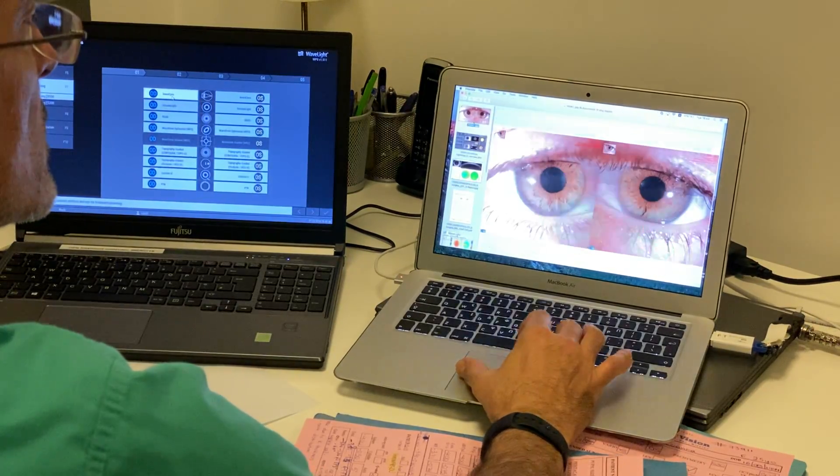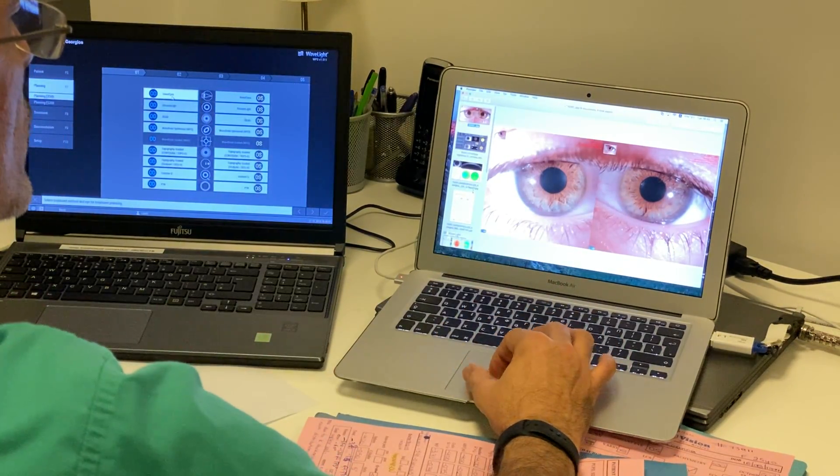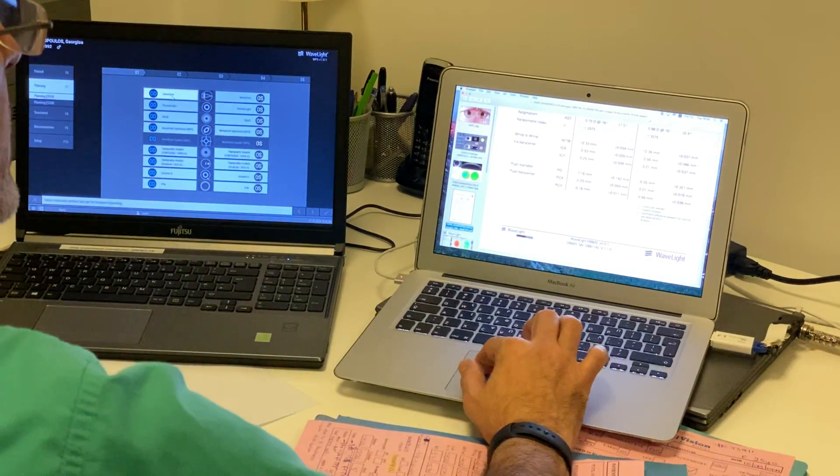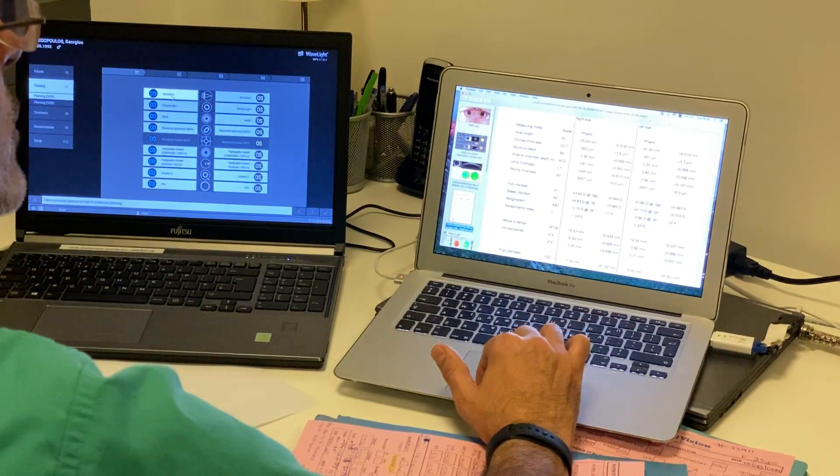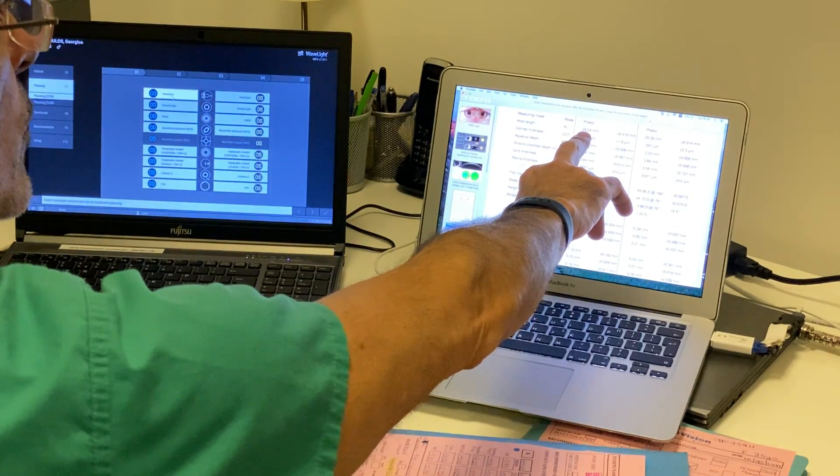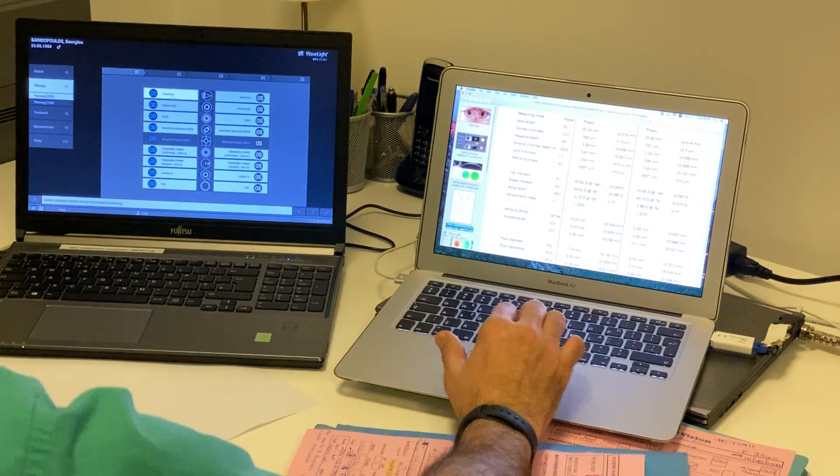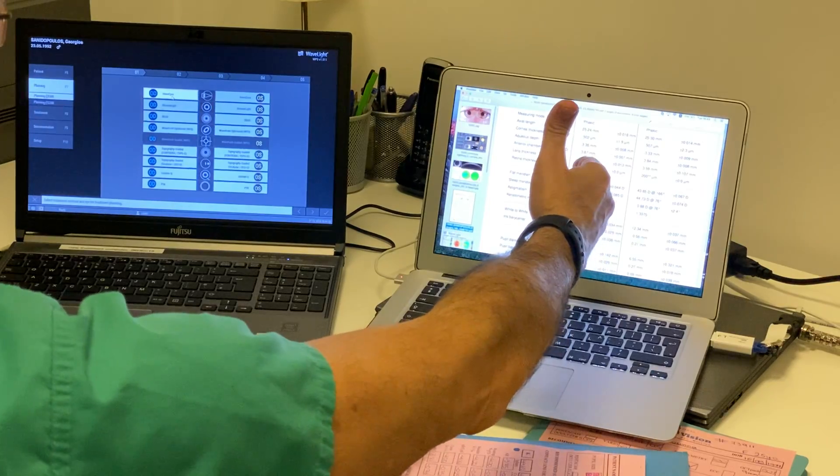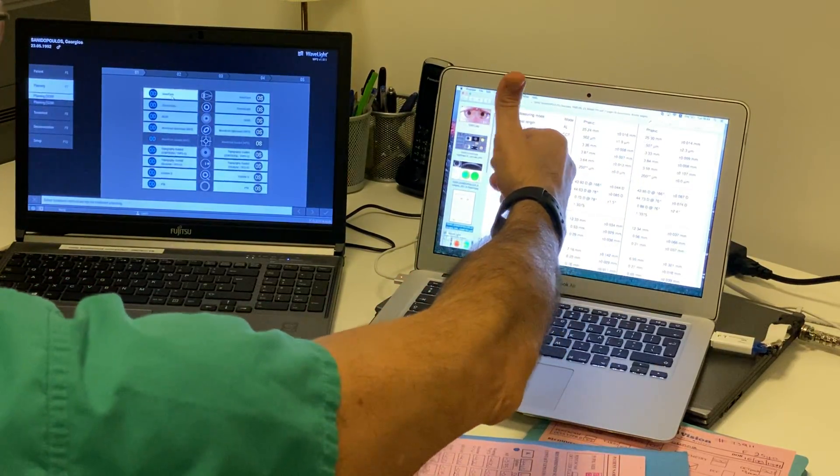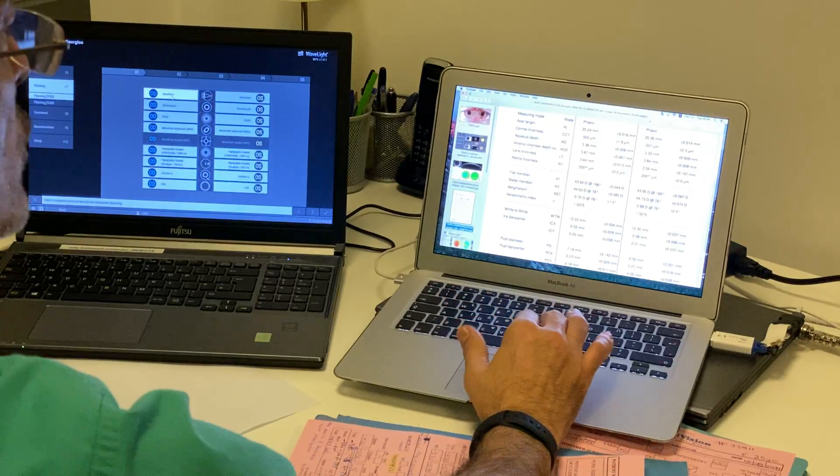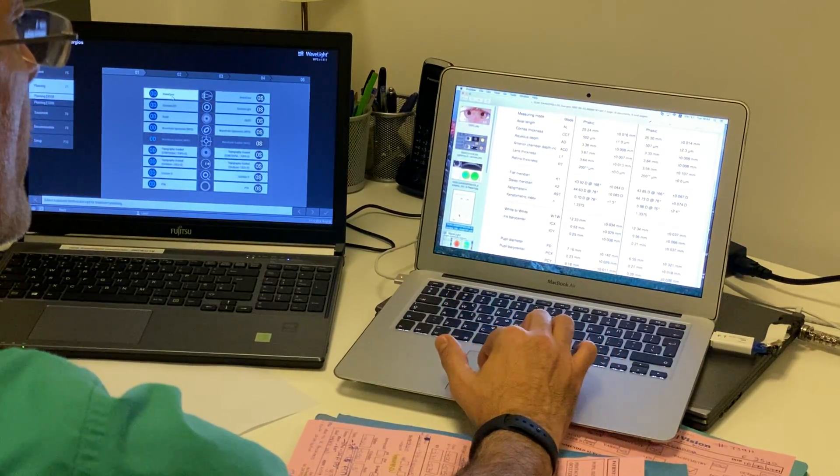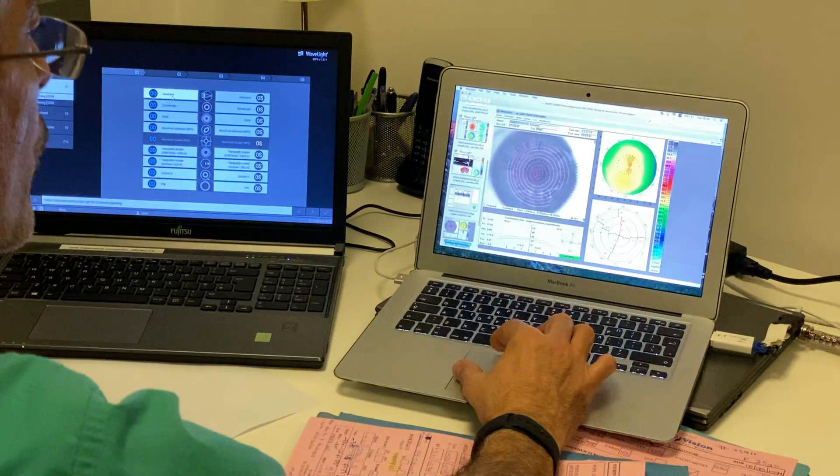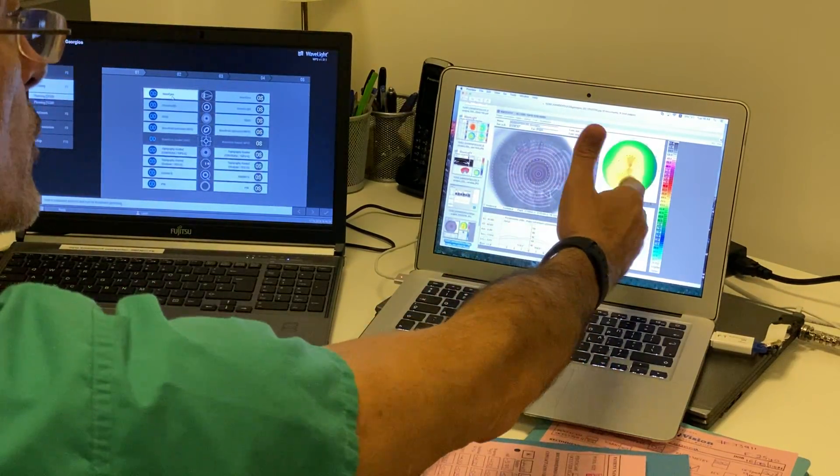This is just an external picture of the right eye. We're using, always in our standard care, axial length measurements in order to confirm this is a right eye, 25.24 axial length measured, along with other parameters of cornea thickness, aqueous depth, lens thickness, and anterior chamber depth.